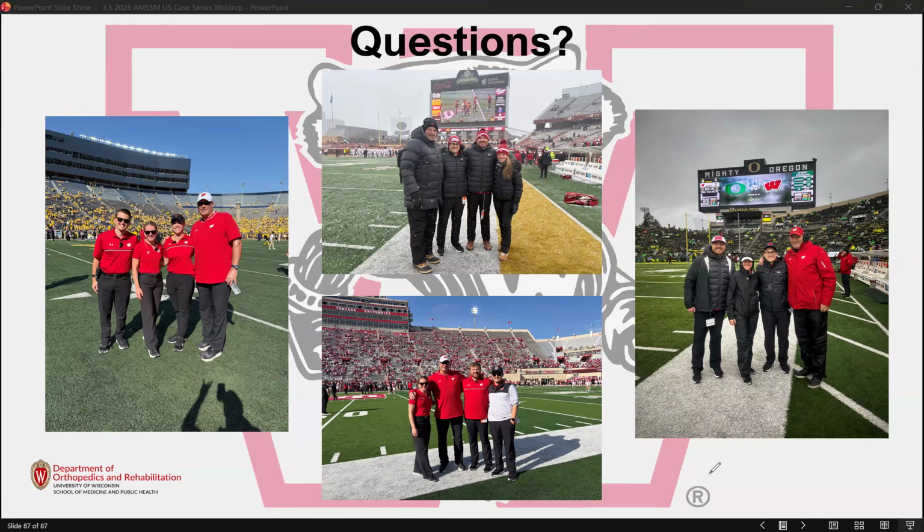Now, if you can get an MRI faster than ultrasound, certainly an MRI has a more conclusive finding. And if you're thinking it's a surgical meniscus problem, that's certainly a different story. But MRI and ultrasound actually show comparable diagnostic rates in certain conditions. So, just one more thought.